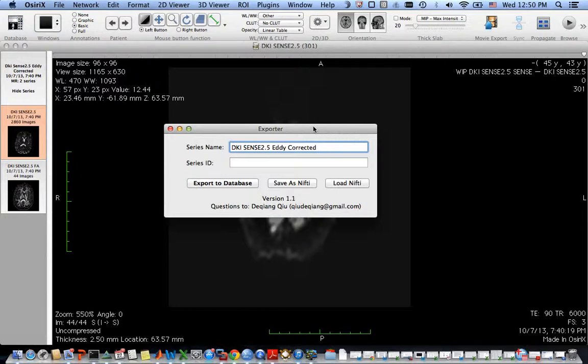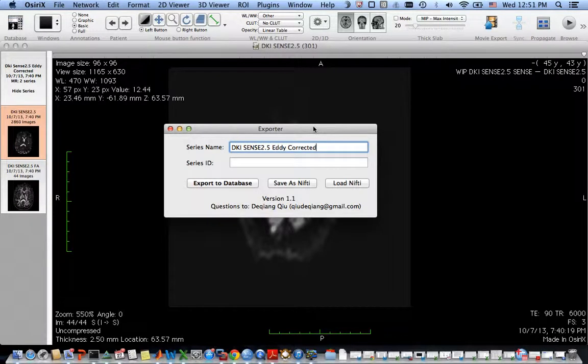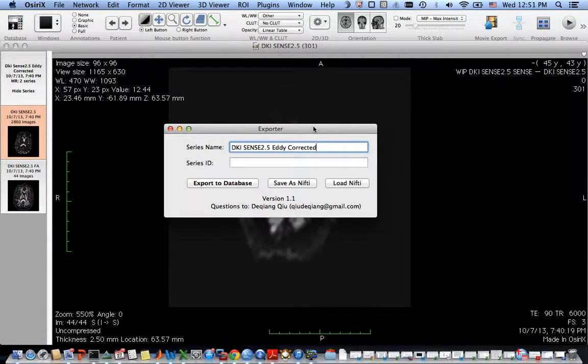However, there is one drawback or limitation from this plugin. If you do some offline processing to calculate FA map from this DTI dataset, and because the FA map has only one time point in the fourth dimension, you cannot use this plugin to load the FA map to the Osiris database.